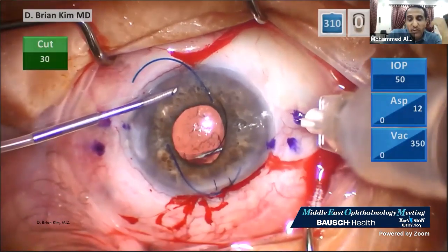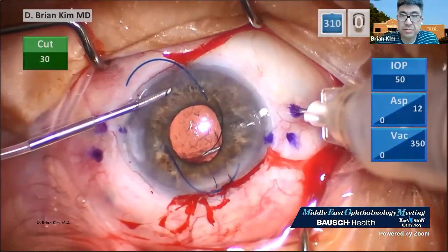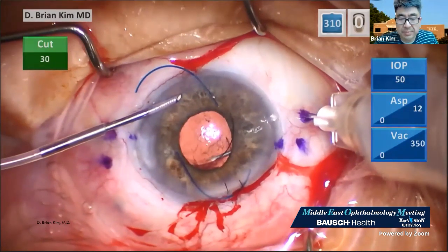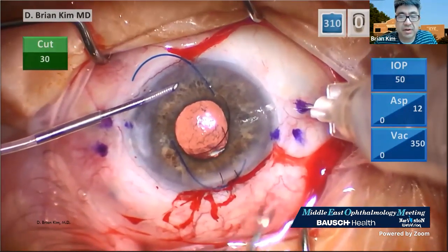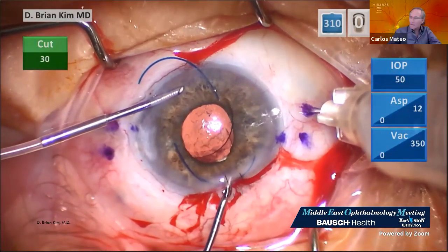Brian, if you want to comment while the movie is working. Oh, can you? So now, you know, I put the trailing haptic first. Can you hear the narration or no? Yeah, I can hear you very well. Can you stop it, Brian?